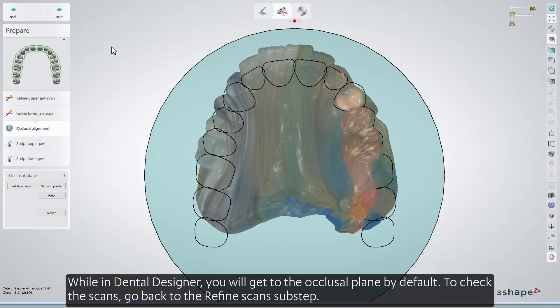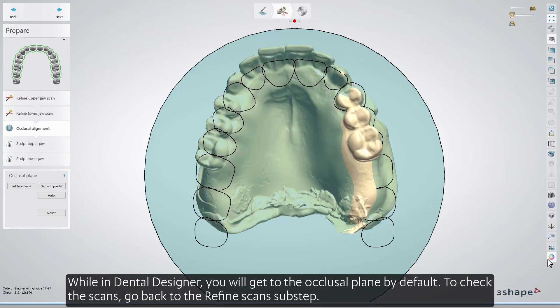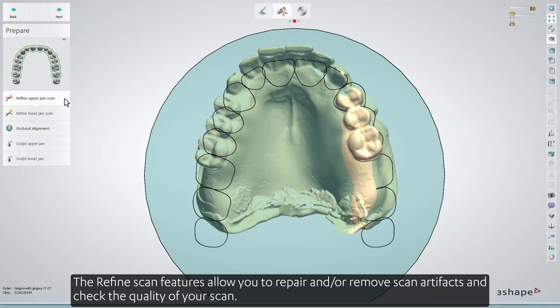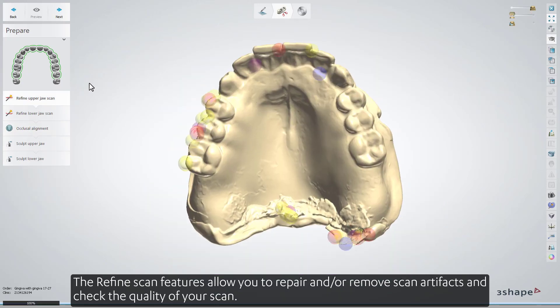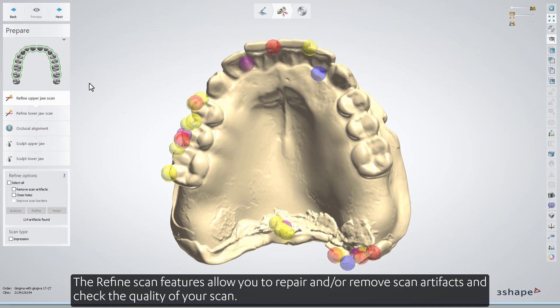While in Dental Designer, you'll get to the Occlusal Plane by default. To check the scans, go back to the Refine Scans sub-step. The Refine Scan features allow you to repair and/or remove scan artifacts and check the quality of your scan.